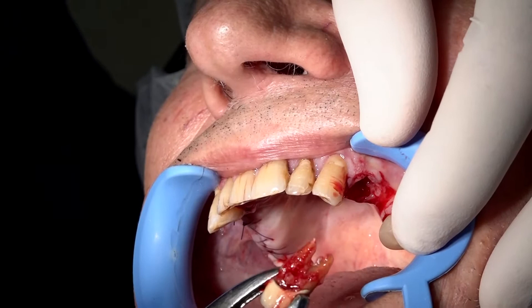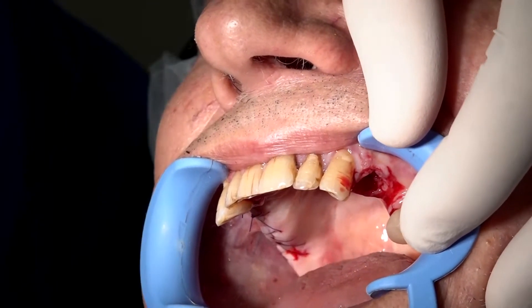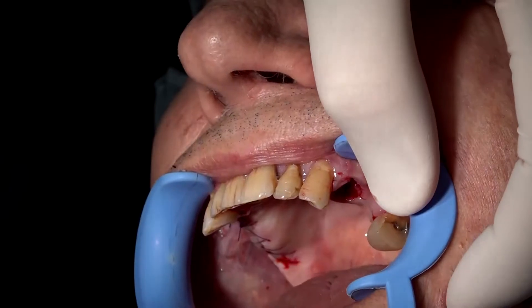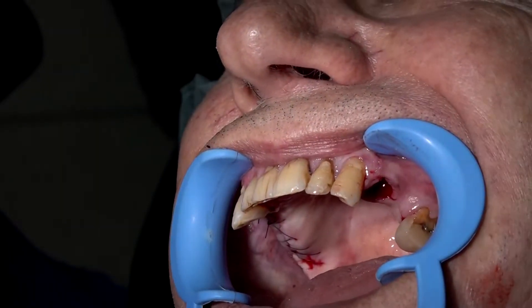Checking that all the teeth were extracted. Now we take a curette and remove all of the granulation tissue.